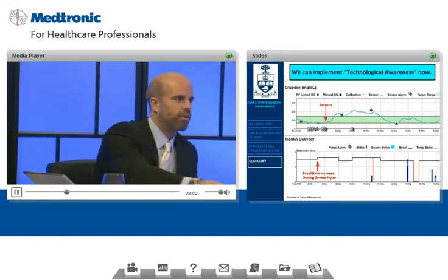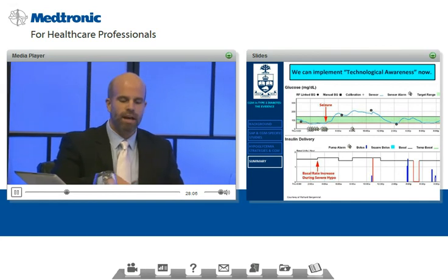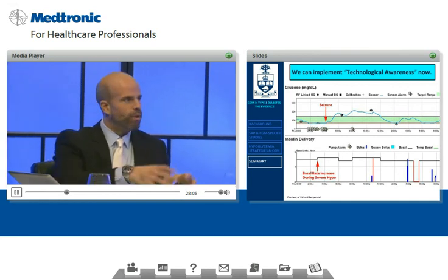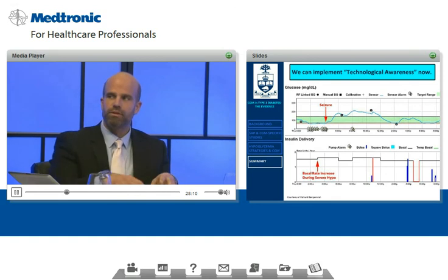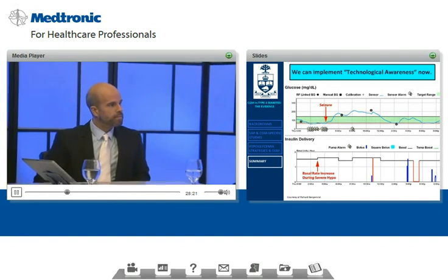Thank you so much, Dr. Perkins, for that excellent review of the evidence as it relates to CGM and type 1 diabetes. In terms of where we've been so far with the research, what do you think a natural progression might be about where we should go or where we will go in terms of future trials as they relate to CGM and type 1?